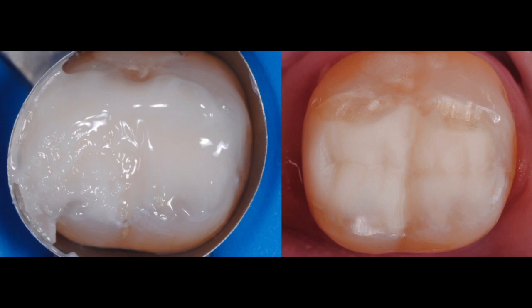We fill up in one increment, followed by finishing and polishing. As you can see, there are less steps and results are as good as with the layering technique.